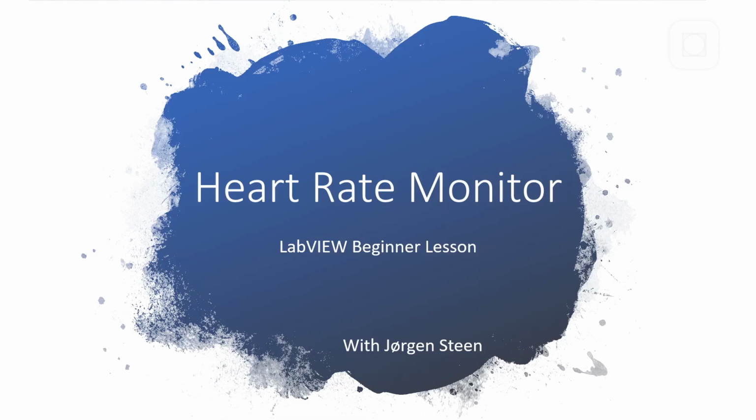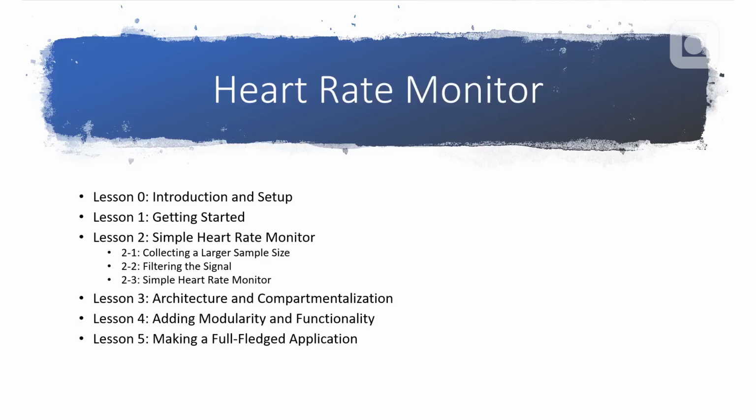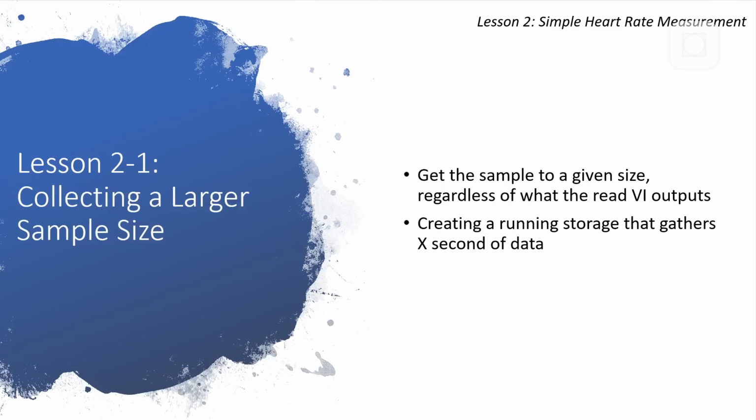This is a LabVIEW Beginner Lesson Series, which focuses on creating a heart rate monitor. This is lesson 2.1, where we create a simple heart rate monitor, and in this lesson we focus on collecting a larger sample size. This is because the read VIs might not always give the sizes of samples we want, so we have to create something that gathers enough data so we get the sample size we want.